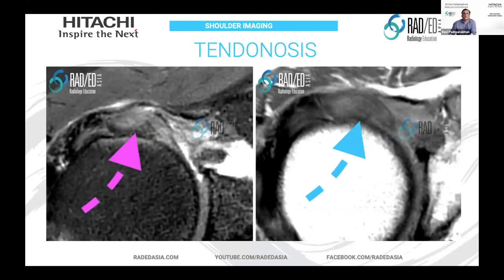The signal is important. We're calling this intermediate signal. Why? Because if you look at the joint space, this is fluid, and fluid is really bright. Tendinosis is not as bright as fluid — it is an intermediate signal. So when we see this intermediate signal we're going to call it tendinosis. If we see a signal as bright as fluid, we will call it a tear.